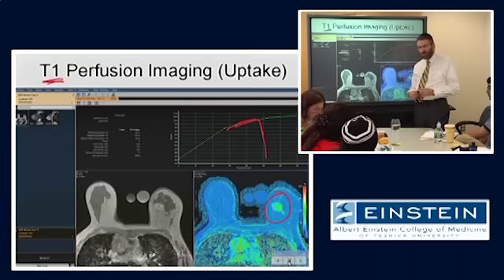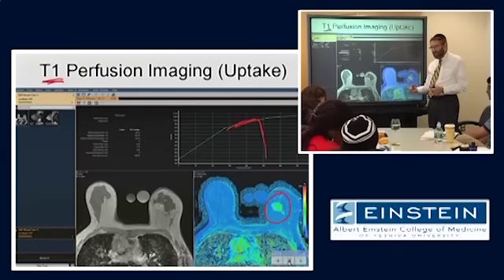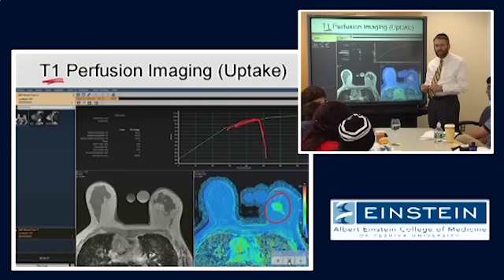So in the T2 star perfusion, we're looking at a vascular effect. Here we're looking at an impact of the gadolinium on the T1 of the tissue. So it has to do with accumulation of gadolinium in the tissue as opposed to transit of the contrast agent through the intravascular space. Okay?